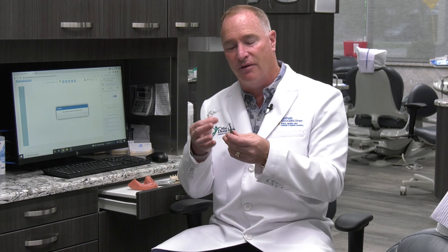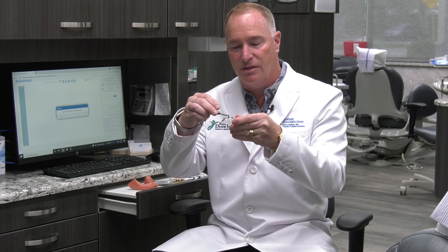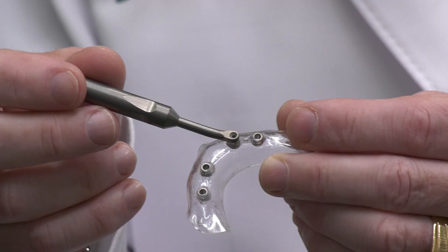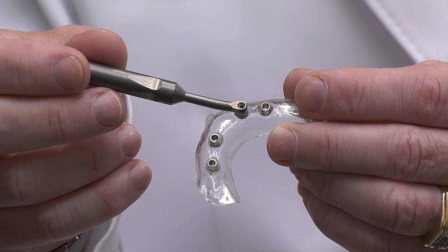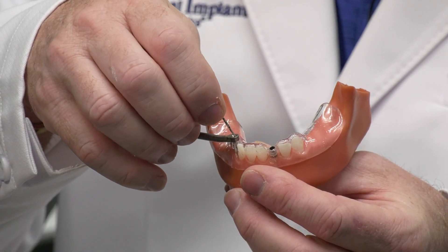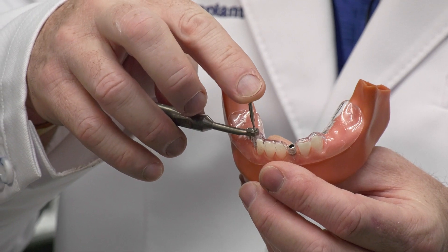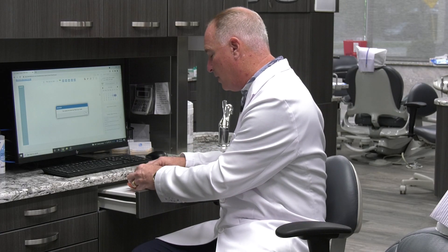You'll have corresponding titanium sleeves that match the size of the drill guide. In this case, a 1.5 drill will go into the pilot drill guide instrument to position the pilot hole right in the middle of the stent sleeve. If you've come to my course, you've seen us use these — this is how it works. The whole point of my discussion today is to encourage you to use the 3D surgical guides.